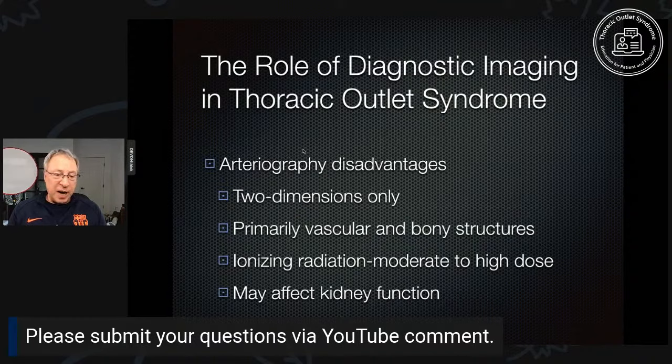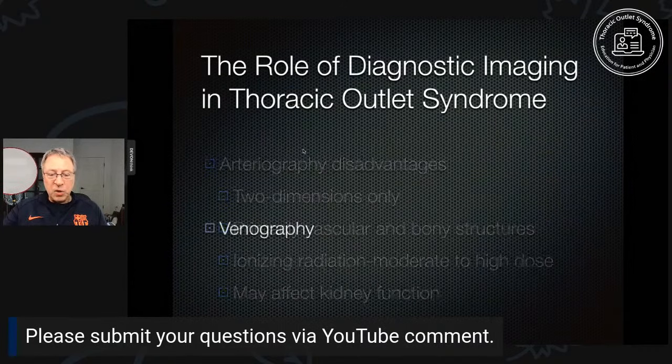And when you inject this dye or contrast, you can affect kidney function. In fact, it goes the other way too. Patients with poor kidney function should not get that dye or contrast. It may make the kidneys fail. Let's go on to the next test.